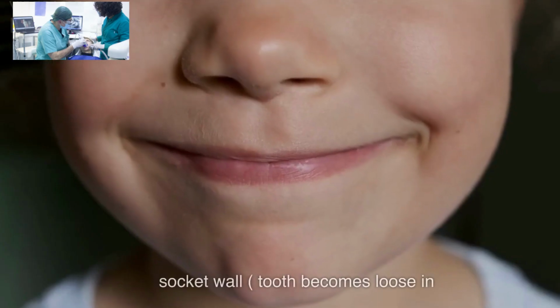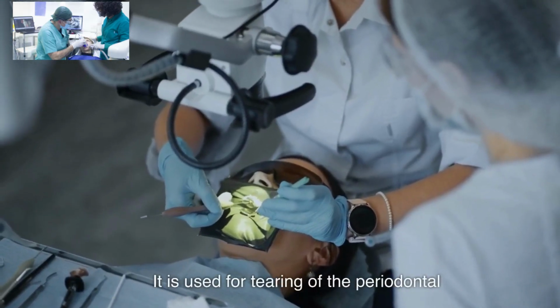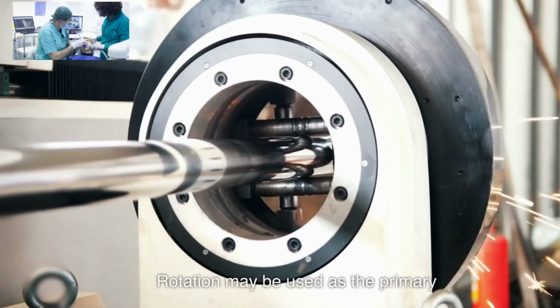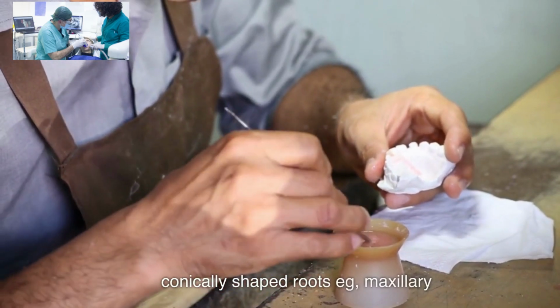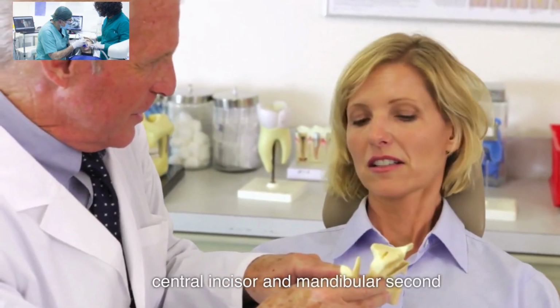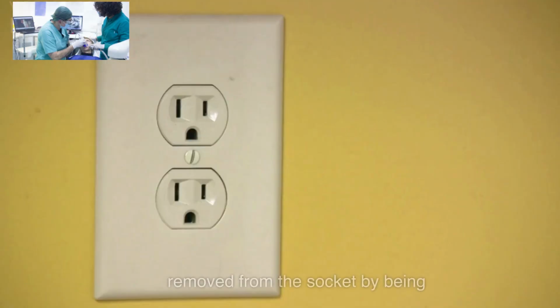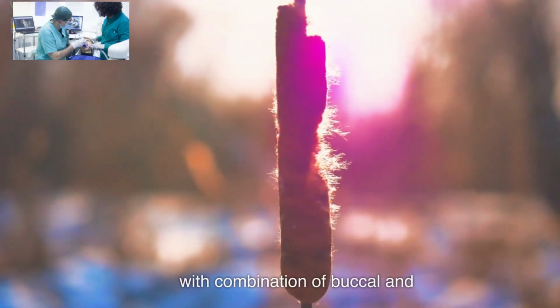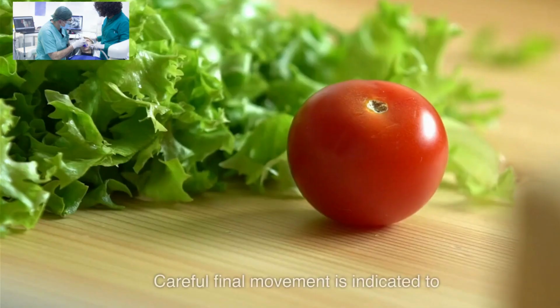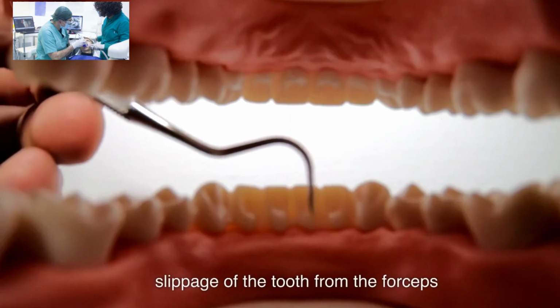4. Rotation. It is applied after dilatation of the socket wall. The tooth becomes loose in the socket. It is used for tearing of the periodontal ligaments. Rotation may be used as the primary extraction movement in teeth with conically shaped roots, e.g., maxillary central incisor and mandibular second premolar. 5. Final movement, by which the tooth is completely removed from the socket by being delivered in a bucco-occlusal direction, with a combination of buccal and tractional forces. Careful final movement is indicated to avoid injury of the opposing teeth and slippage of the tooth from the forceps.